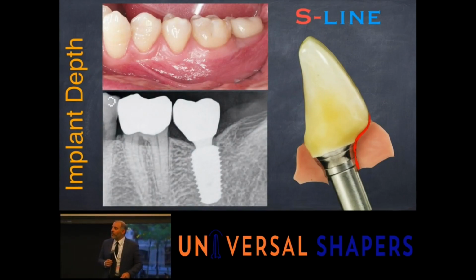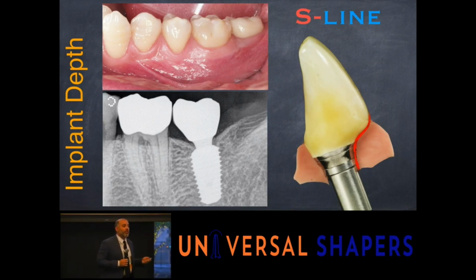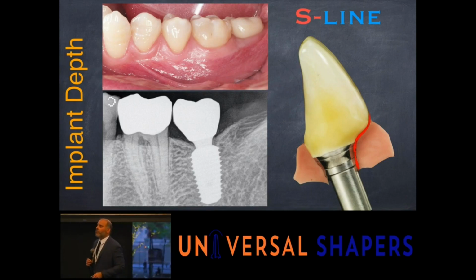And you can see this type of implant again, where it's narrower at the crest, right where the abutment is, and it looks a little bit like a lollipop on a stick. We don't want it to be too small of a stick, but we want to have enough abutment for support so we don't have fracture. These conically connected implants combined with that S-line type of shape can give us some beautiful soft tissue.